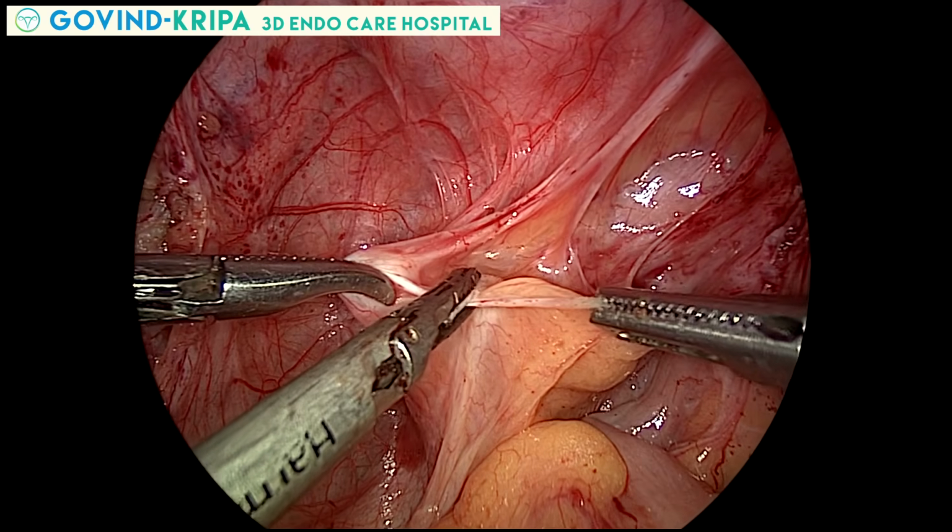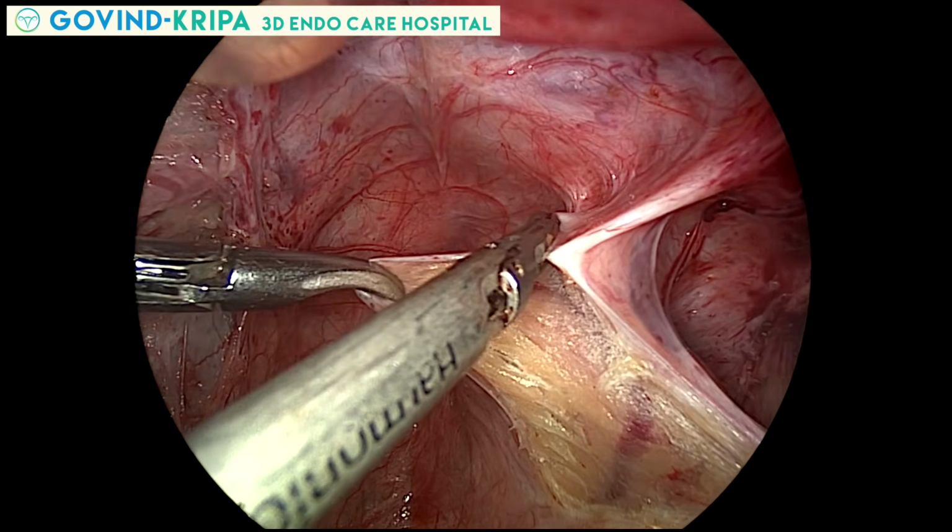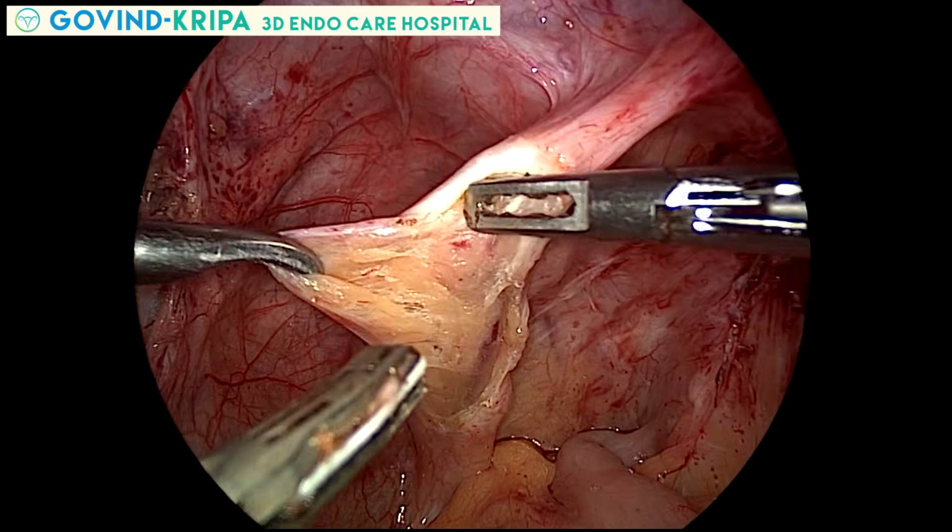Medial pararectal space dissection is done distally because there is no major pathology in the proximal part.